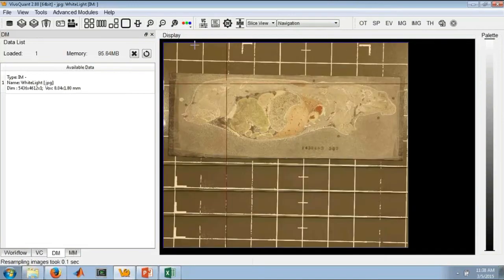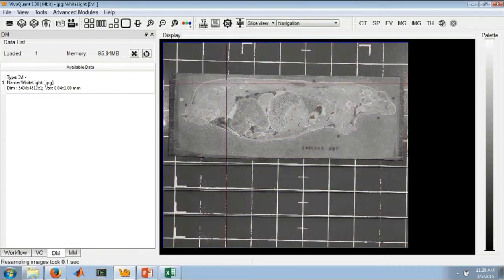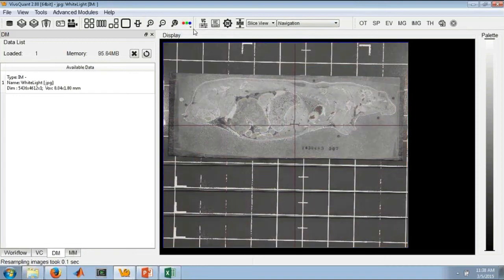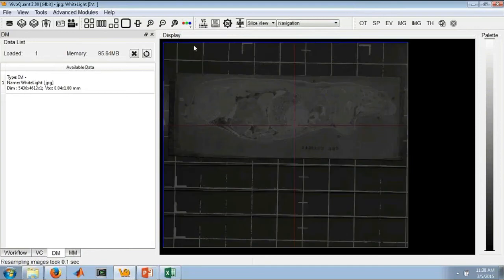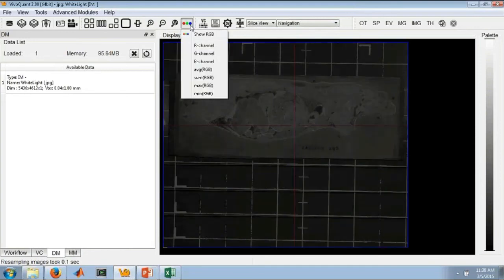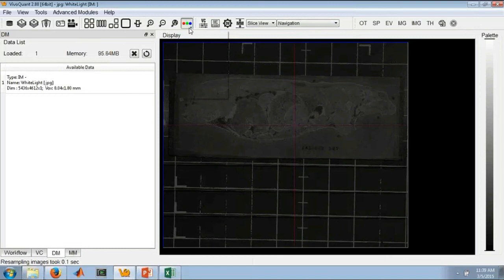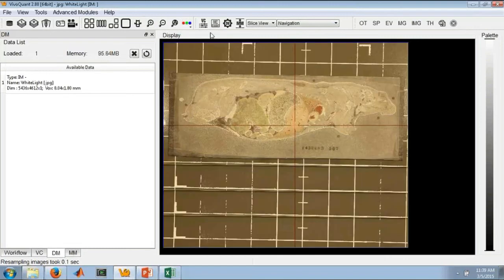As this is RGB data, we've also added some support for viewing the individual RGB channels. If we turn off the show RGB option, we're now looking at just the grayscale version of the data. We can show just the red channel, the green channel, an average of the RGB channels, or really anything in this dropdown. And of course, we can show the RGB.